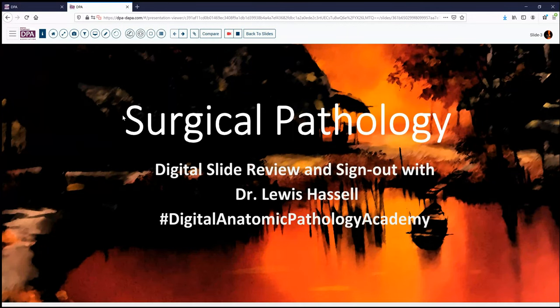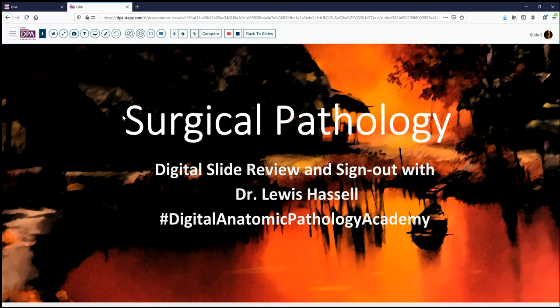Hello. Welcome to another session of digital slide review and sign out. I'm Dr. Lewis Hassel, coming to you from the University of Oklahoma Health Sciences Center. Our program is part of the Digital Anatomic Pathology Academy, drawing on the strengths provided by Digital Pathology Association and PATH presenter.